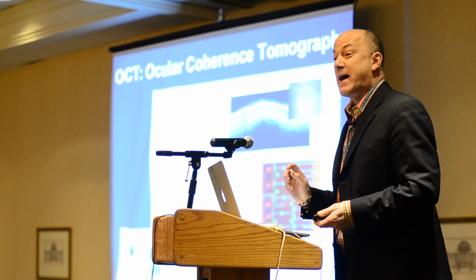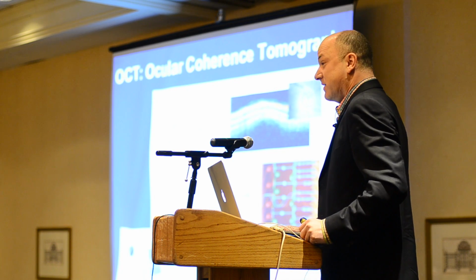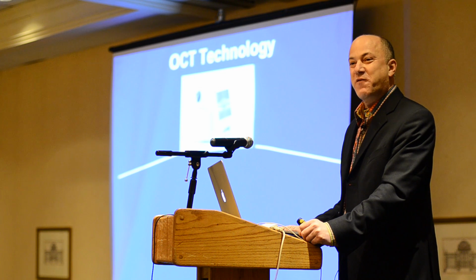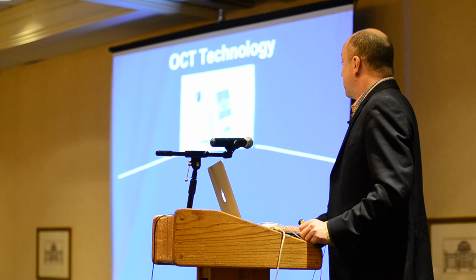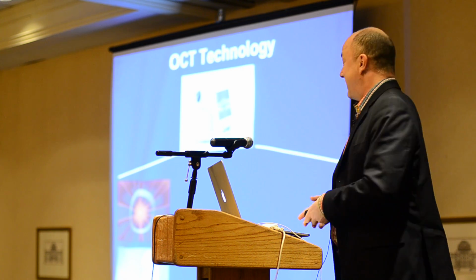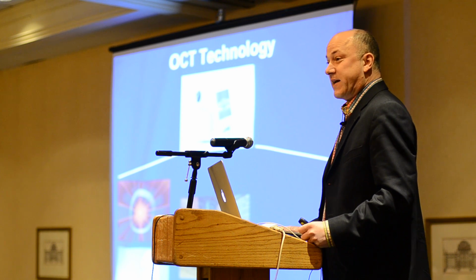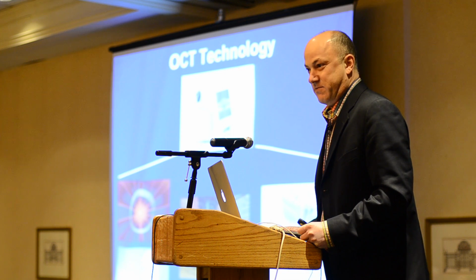I know that makes absolutely perfect sense, so I boiled down the technology simply into this. We have an OCT machine here. Many of you have had your chin on this machine for one reason or another. And we use what's called, as Dr. Eva would say, a laser, okay? A laser is then transmitted to the back of your eye, and a bunch of robotic elves then pound out an algorithm and give us a pretty picture, okay?